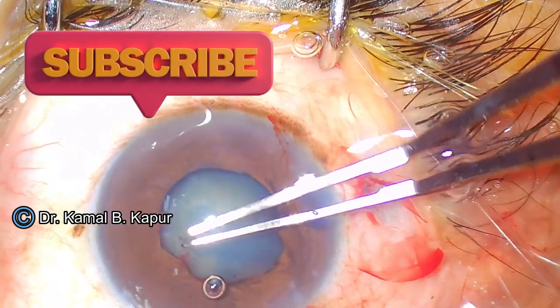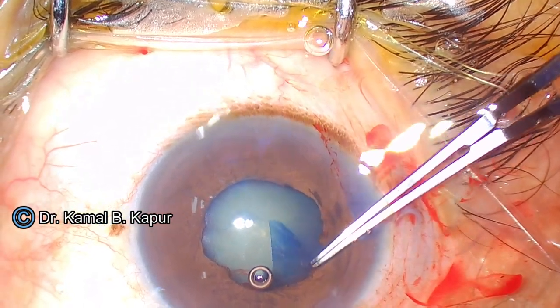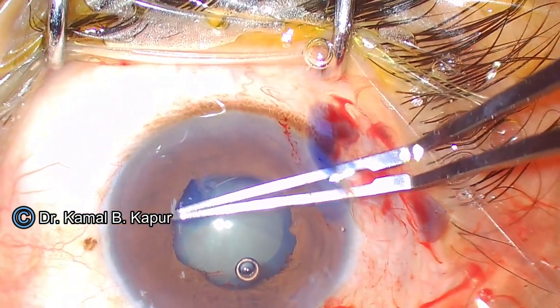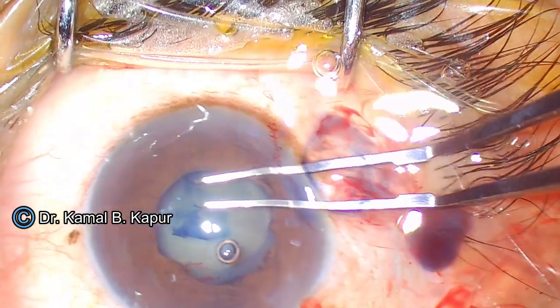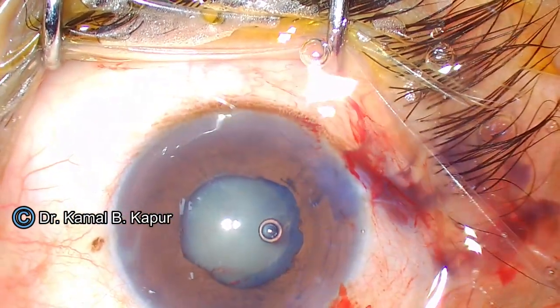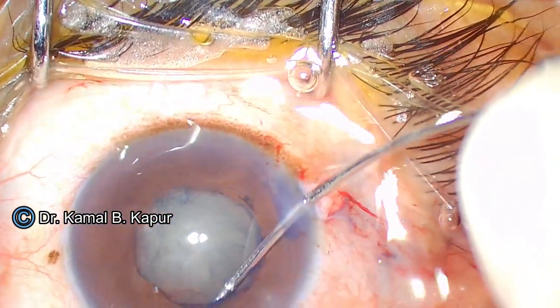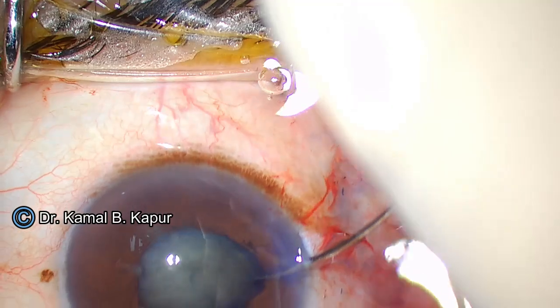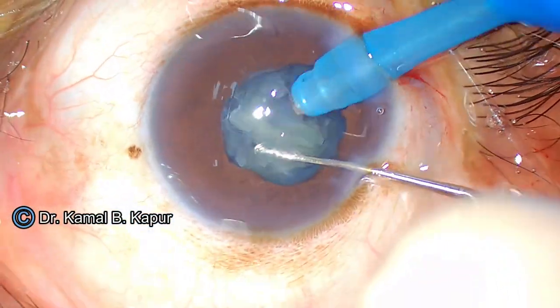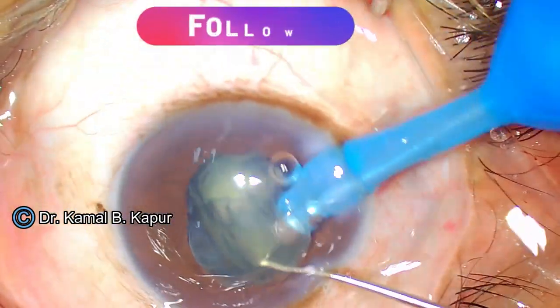Once this is done, we proceed with our capsular rhexis. One thing to remember is in such cases, sometimes our rhexis is fibrotic and sticky and the capsule is fibrotic and can be brittle. So sometimes we end up making a smaller capsular rhexis. One word of caution is when you do your hydro procedure, especially your hydro delineation and hydro dissection — while doing hydro dissection, the pressure of fluid doesn't have to be very aggressive. Otherwise, you can have a capsular block and cause a posterior capsular opening. So if you have a smaller capsular rhexis, make sure that the hydro dissection is not very aggressive.